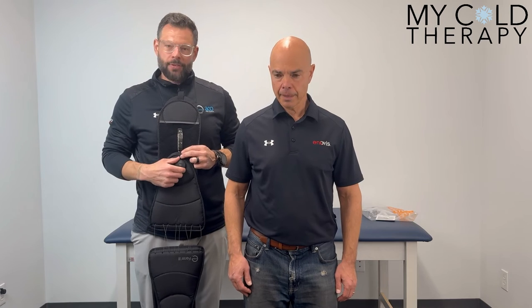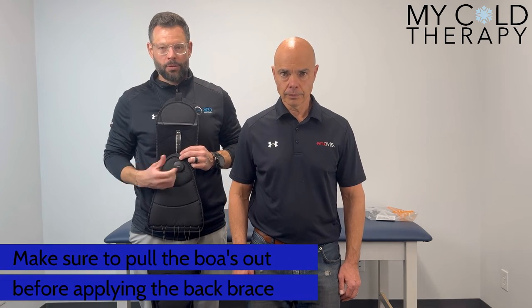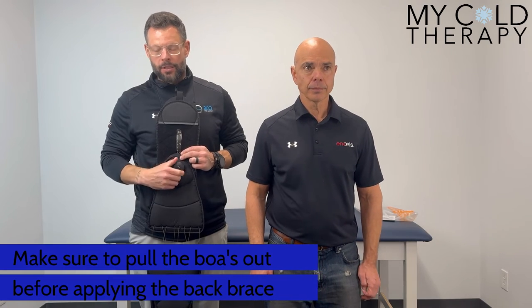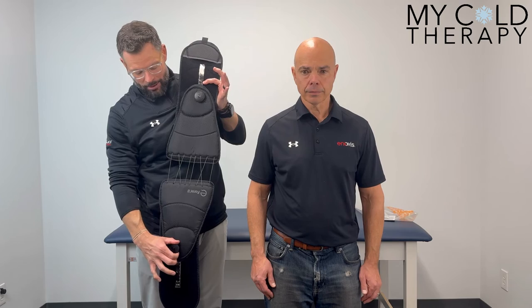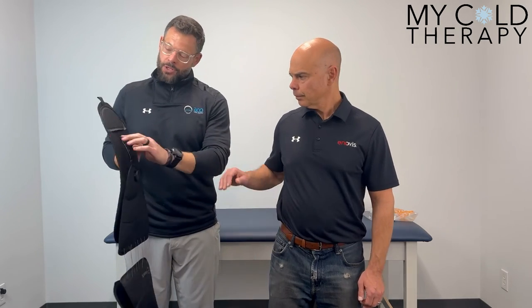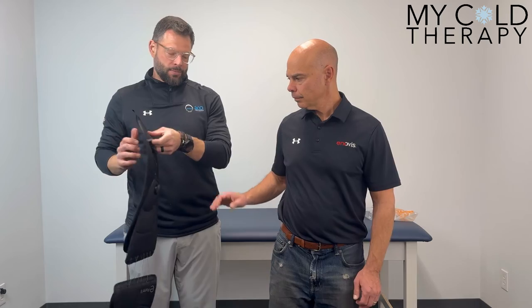Your brace itself — how we adjust it for tightness. We have our boas here, so we're going to go ahead and pull our boas out. You're going to hear it click. What that's going to allow us to do is separate that brace as large as possible. You're going to have your patient put their right hand into this mitten.